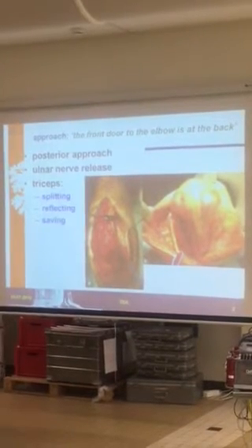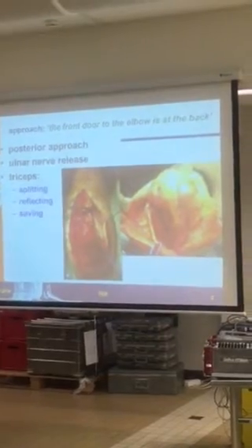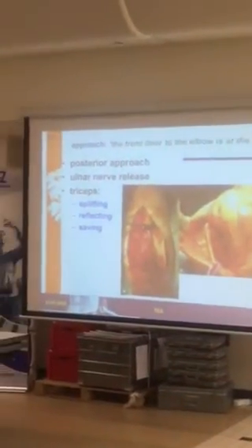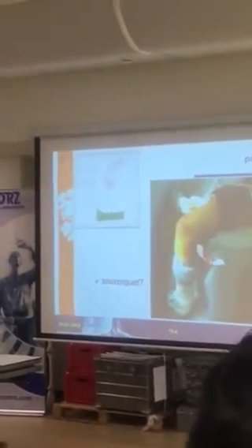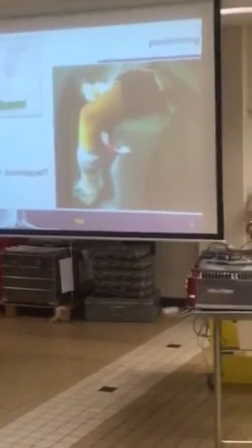Otherwise you remove it and keep it out of your working space. And what about the triceps? You can split, you can reflect, or you can save it. And first, in position, I prefer to do a lateral position, so on the right side of the slide.